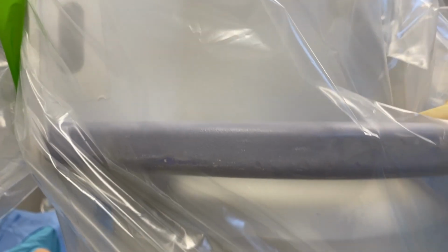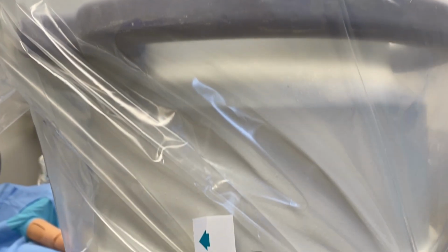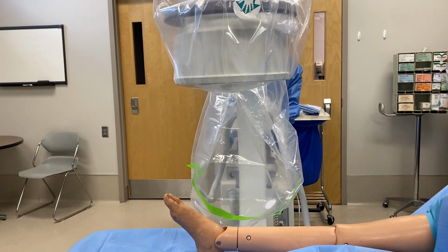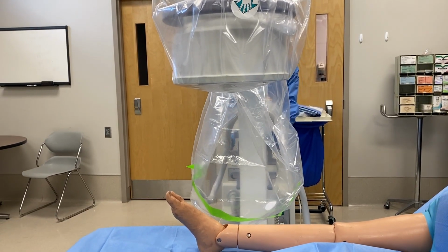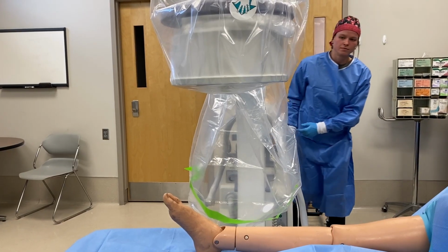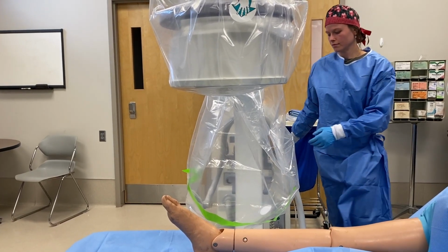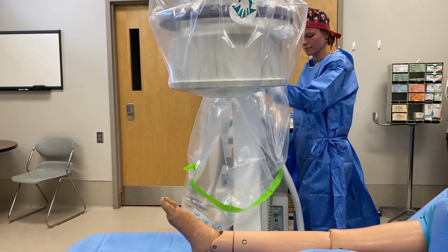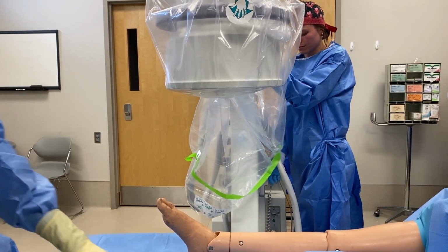The image intensifier is located on the top of the C-arm, above the patient. It is key to lower the image intensifier as close to the patient while maintaining a sterile field. Having the image intensifier closest to the patient reduces patient dose, reduces scatter to occupational workers, and improves overall image quality.